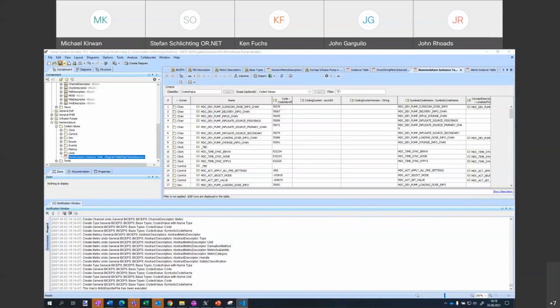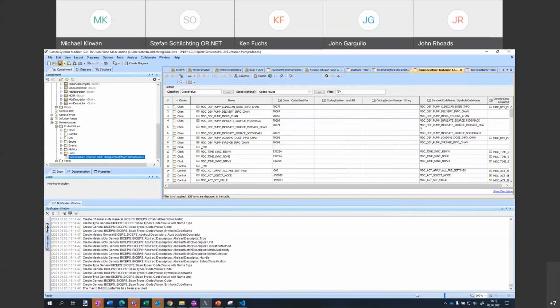So it's not just everything up to saying go, but I think, if I remember right, you have a control that actually says start. Yeah, that's also something that's in there. And so it covers all of those functions. But then the other really cool thing here is you did the Python script that actually searches the Cameo database, finds where to start, and then generates the BICEPS infusion pump specialization. And then you can use the BICEPS XSD to validate it. So you can actually have a validated XML generated straight out of here.